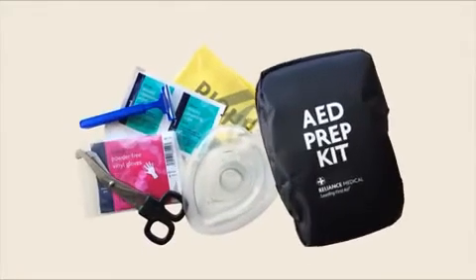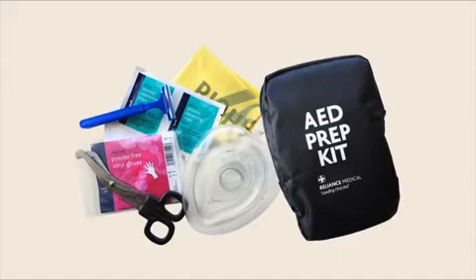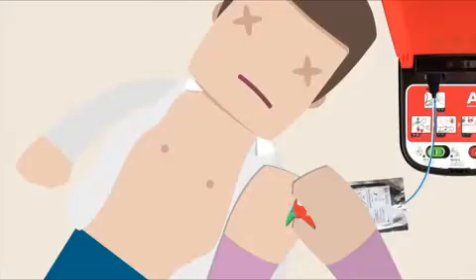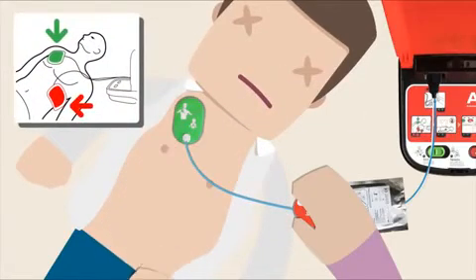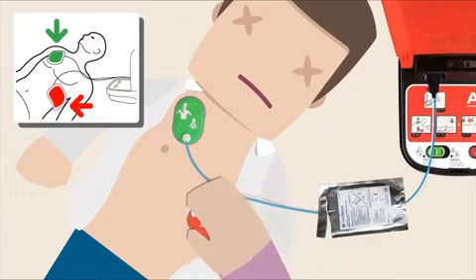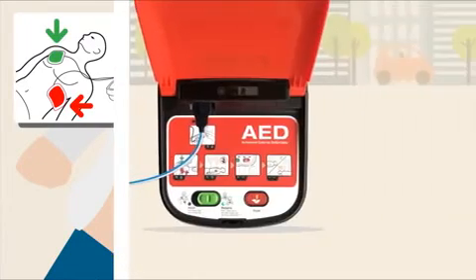If the person has a lot of chest hair, you may have to shave them — the unit may have an accessory prep kit which includes a shaver. Using the picture guide, place the green pad under the right collarbone, then place the red pad beside the left nipple, just on the ribs below the heart.